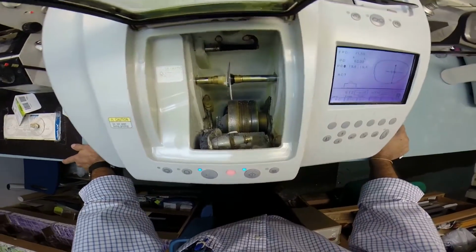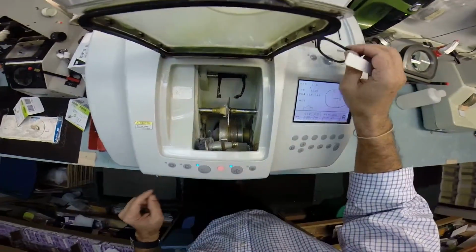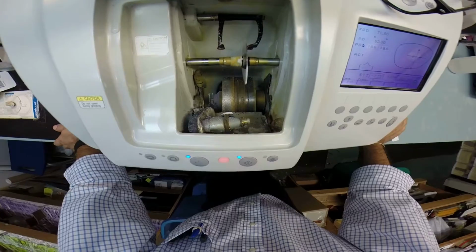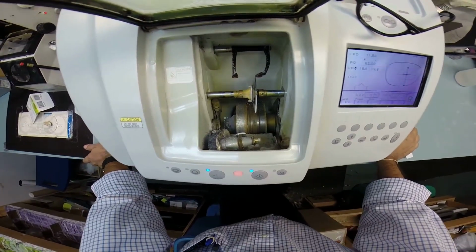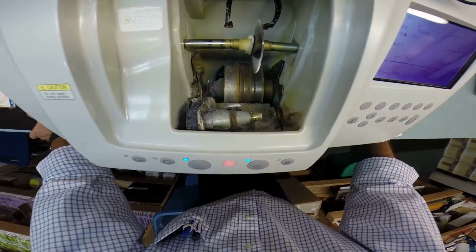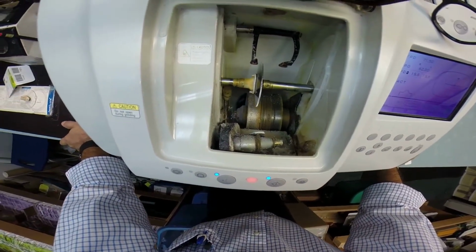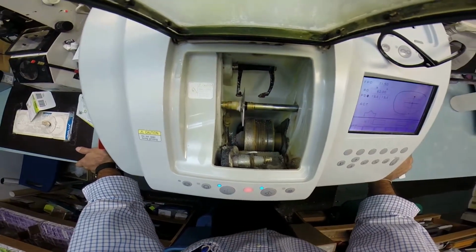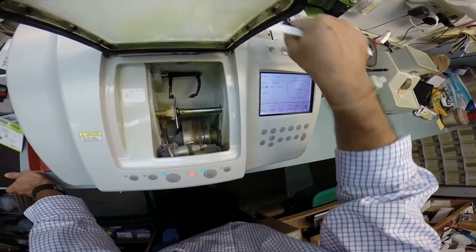So the caliper is going to come down, and it's going to trace the shape of the right lens to make sure that this lens is large enough to fit into the frame. It is starting with the rear surface, the back surface, which happens to be the concave surface. And then it's going to move over and trace the convex side of the lens, which happens to be the front surface, all the while measuring the thickness of the lens to know exactly where to place the bevel so it'll fit best inside the frame.